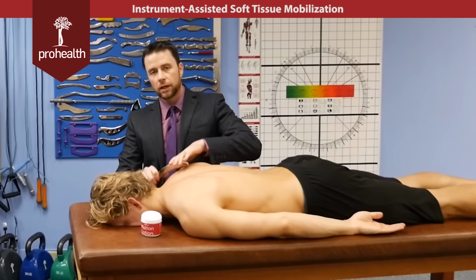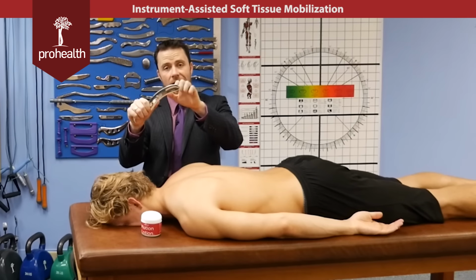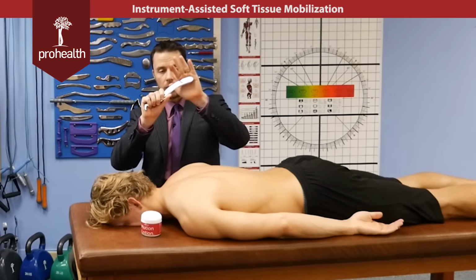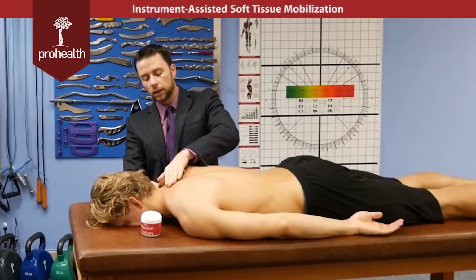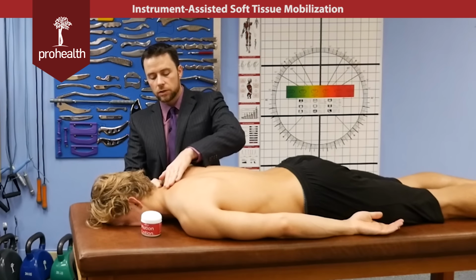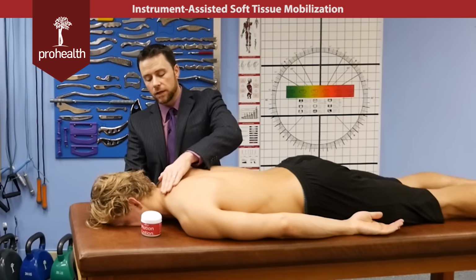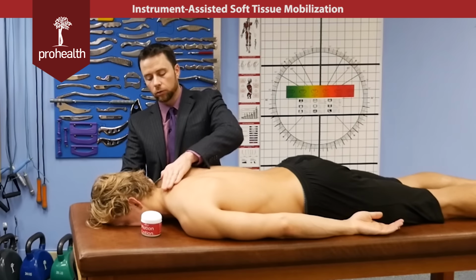A couple of things to realize, biomechanically, this is an easy action for me to perform. Your strongest action is actually pulling in like this, so if I put my hands over top, using the index, using my fingers, or even the upper part of the palm of the hand, you can hook in and get a very specific contact and slowly scan through and see if you notice any tightness that you want to work on as a light superficial scan to begin with, and then you can increase the pressure and start to drag through that tissue and lengthen out the fibers.